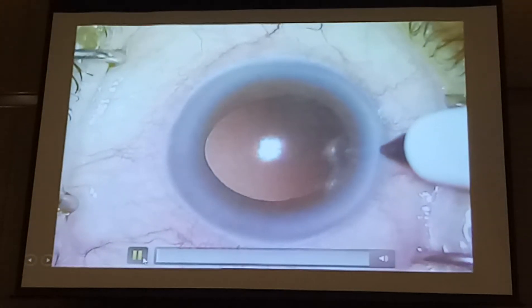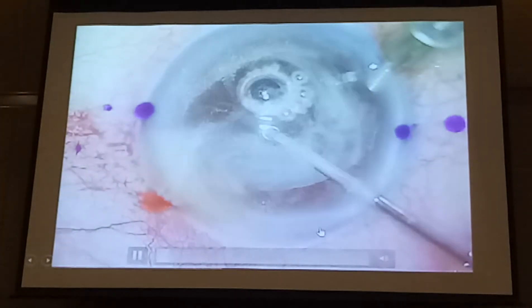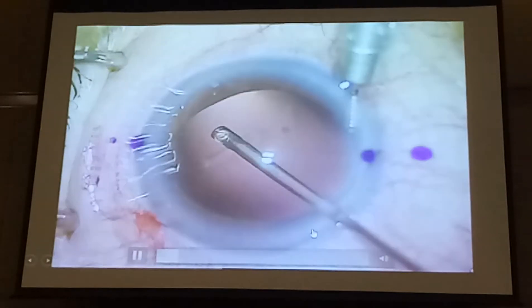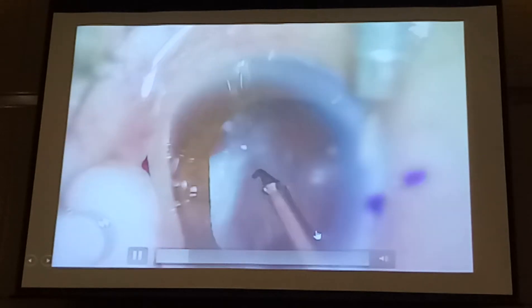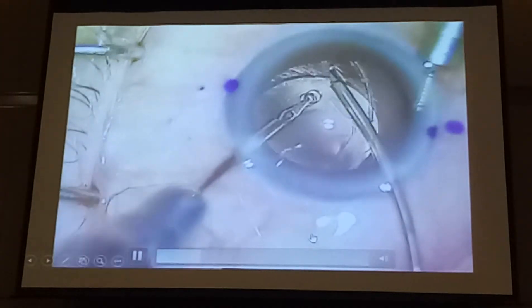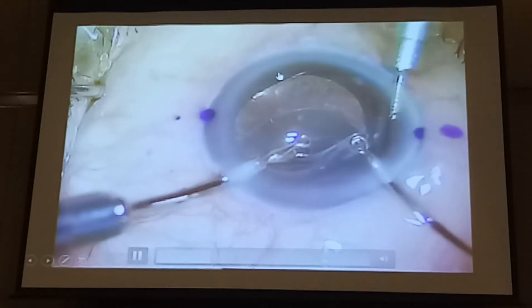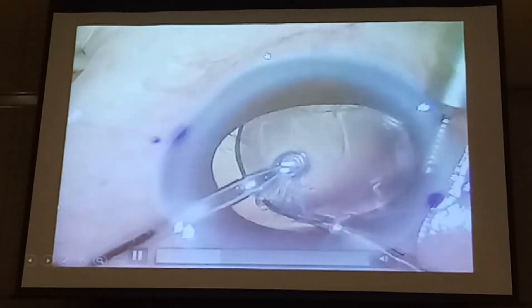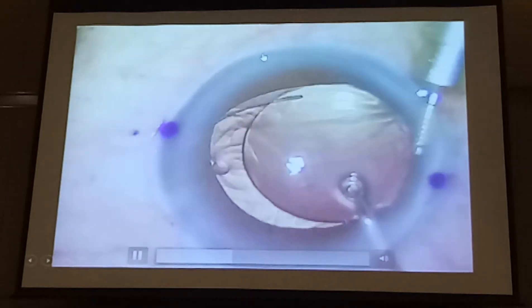I'll just show you another case here, using a 27-gauge needle. Generally I do not like to use the Yamani technique because I can't always get it perfect. You see me picking up this lens by indenting — I've caught the capsular bag here. For this, you need to strip the capsular bag. You don't have a capsular tension ring here, so really it's quite easy. This bag is like a dead bag — no response at all, perfectly clear, and easily done.